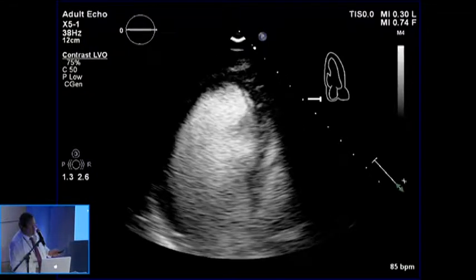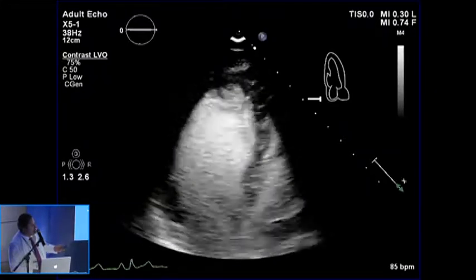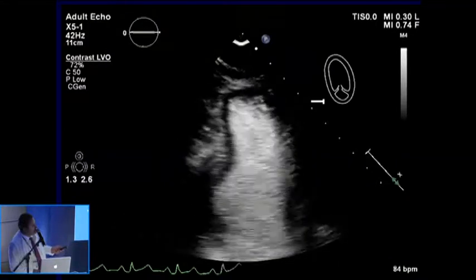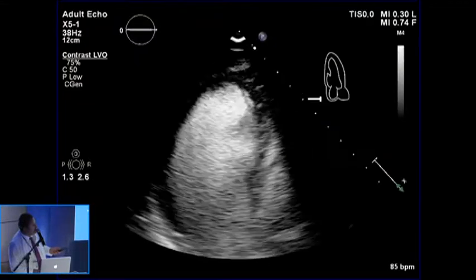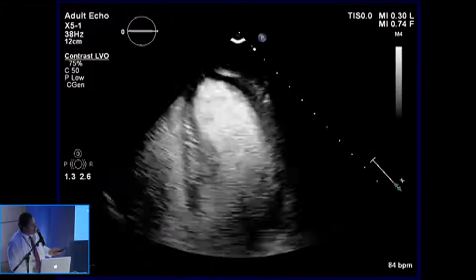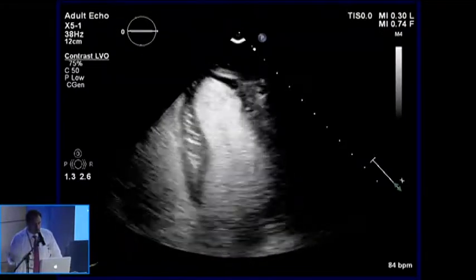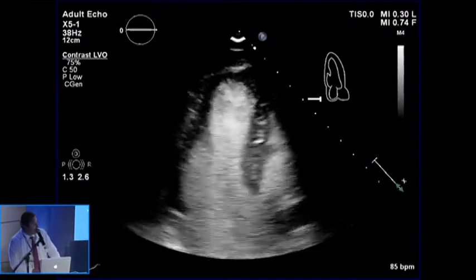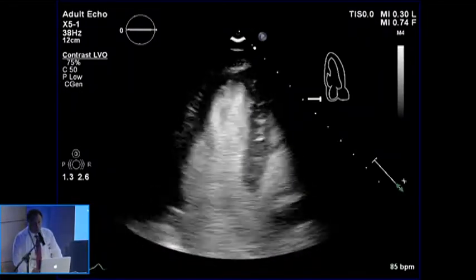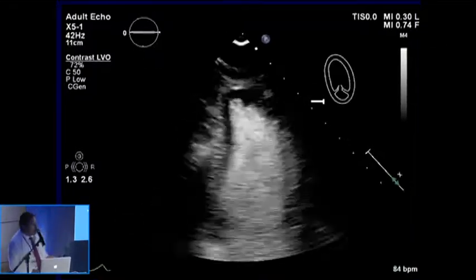It is abnormal, indeed. The contractility, what you see in the ventricle is contrast. But there is a segmental contractility disorder here, very significant. Another very important contractility alteration here. And over here, also, a contractility alteration. So she had chest pain, she had sore throat, she had some fever. She came with this that looks like Takotsubo. The problem is that epidemiologically, it doesn't appear to be a Takotsubo, but she's a young woman, 44.